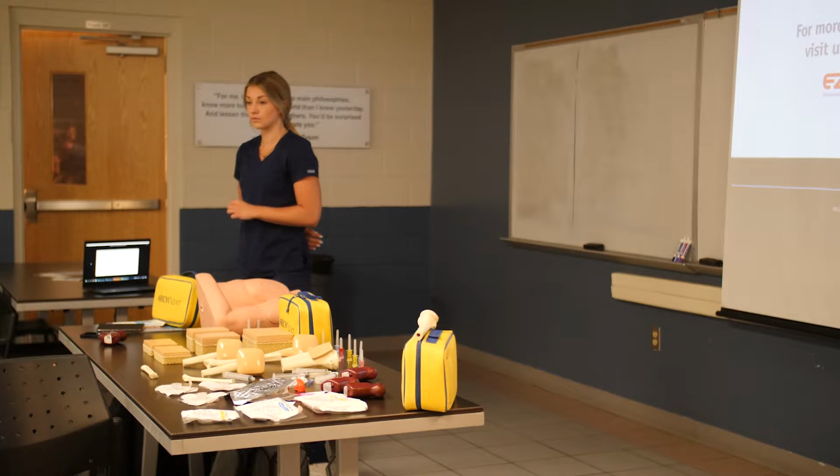On this little patient, I'm gonna go about 1 centimeter above the patella, and then about 1 centimeter medial. We can just go 90 degrees into the bone. So not sideways, up, down? Yeah, perpendicular. Yep. Okay, does that make sense?